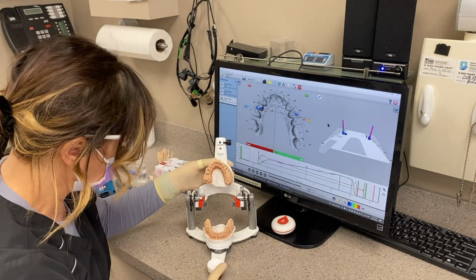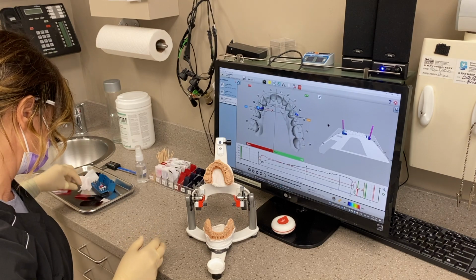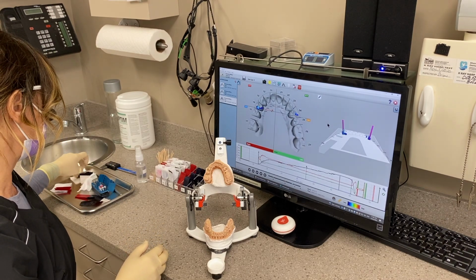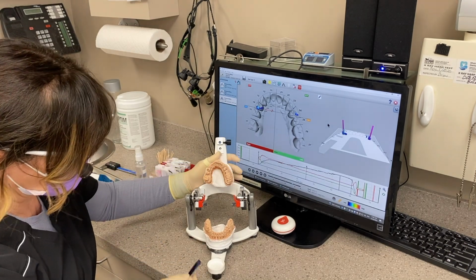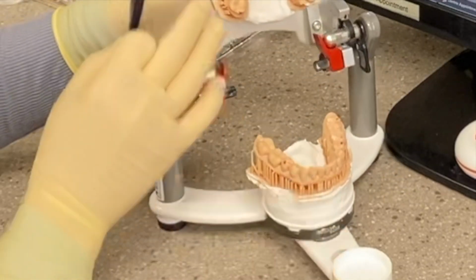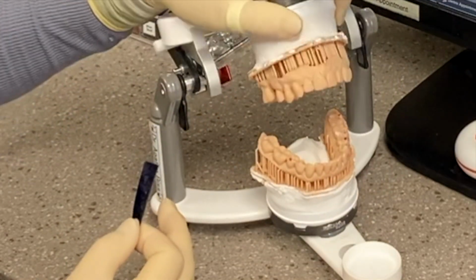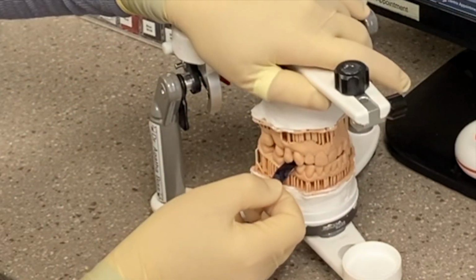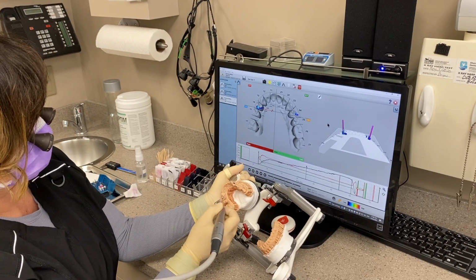Okay, so now I've got 1-4 and 2-4. I'm going to mark that one in blue. And 1-4 is the tooth that's got a ton of bone loss as well, and it's actually over erupted. So I'm going to mark that one. And this is on the incline, so we're going to do the cusp again.